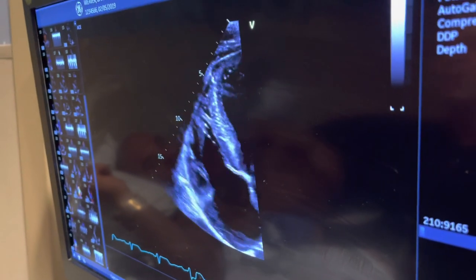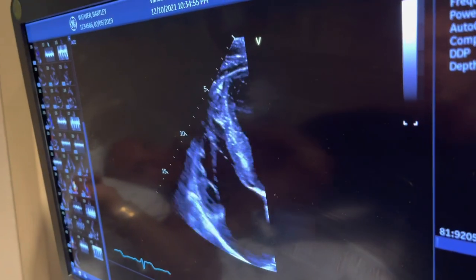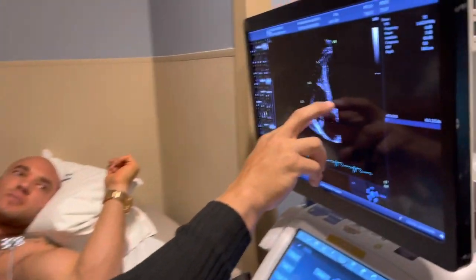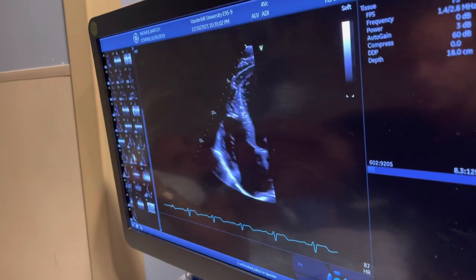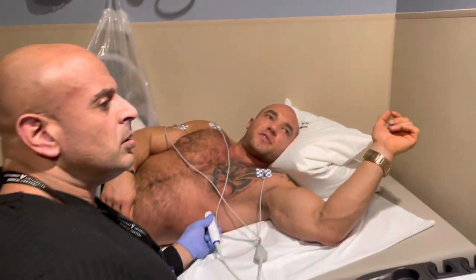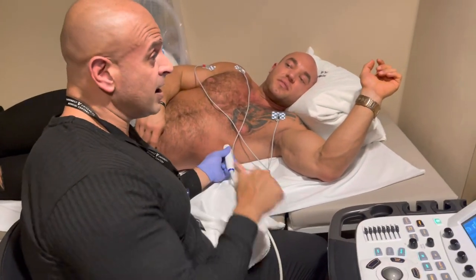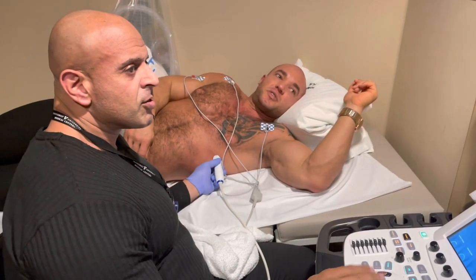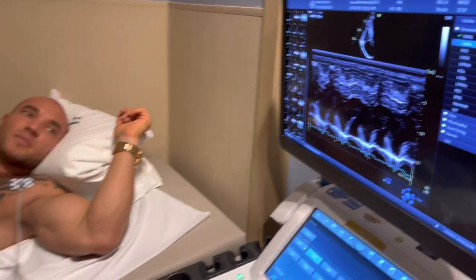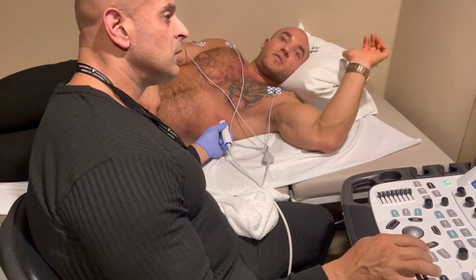Now we're going to look at the right side of your heart — that's the right ventricle. For people with untreated sleep apnea, this chamber usually gets very enlarged. How does mine look? Very normal. Because I've been on the CPAP for a few months now. And you don't sleep without it? No. Thank god you're on it. Sleep apnea causes a lot of heart problems — specifically the right ventricle.